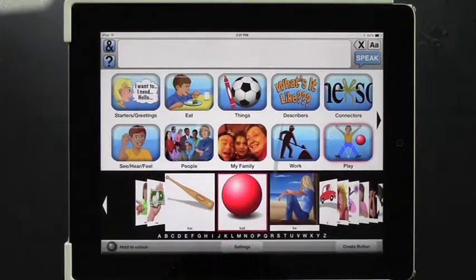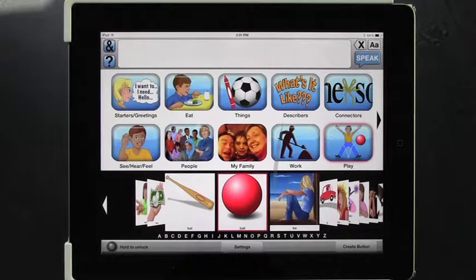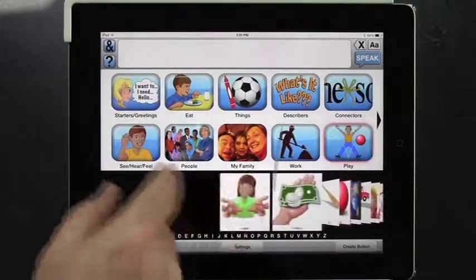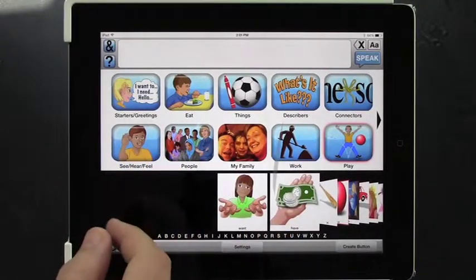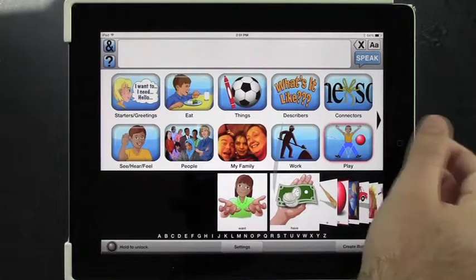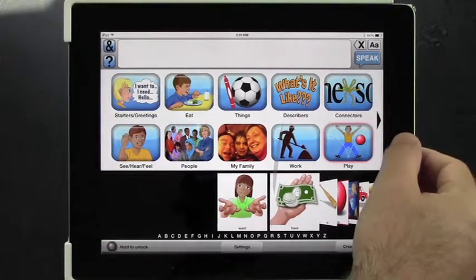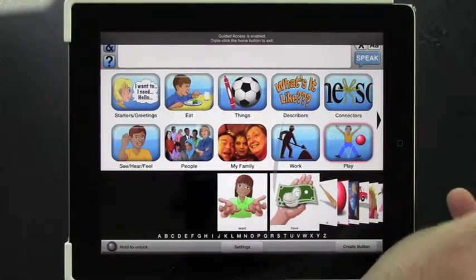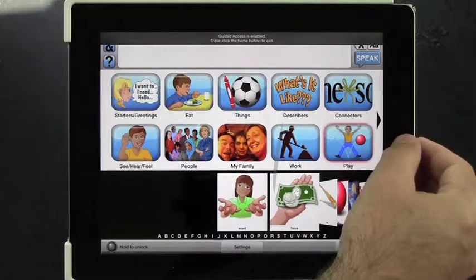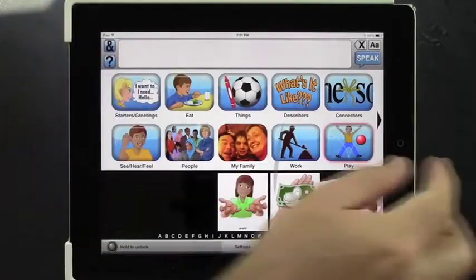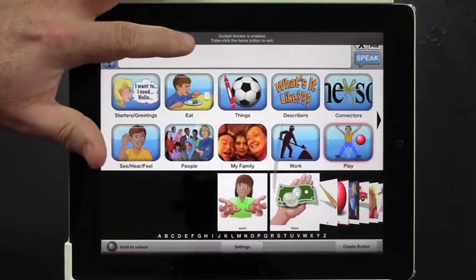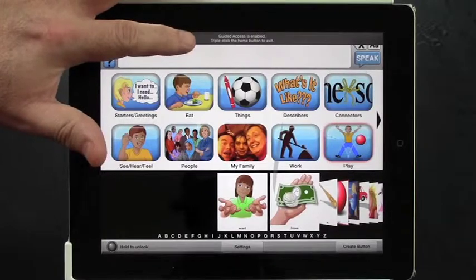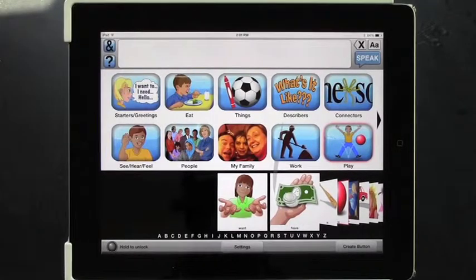And it says Guided Access started. Now, what does this do? It means that if a child wants to leave the app — a lot of these children will hit the home key — you hit the home key and nothing happens. It gives you this little notice at the top: Guided Access is enabled. Triple click the home button to exit.